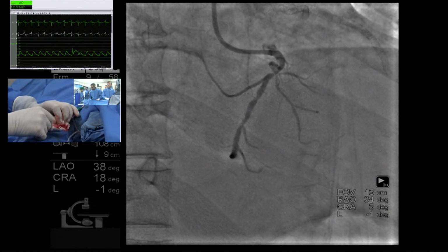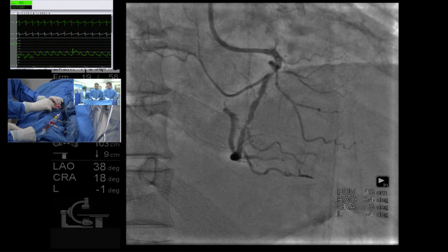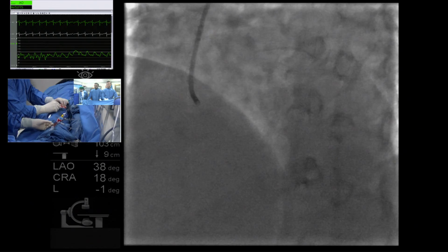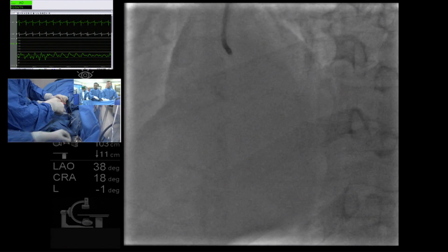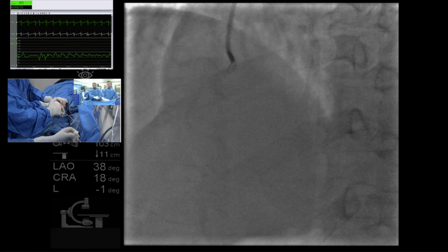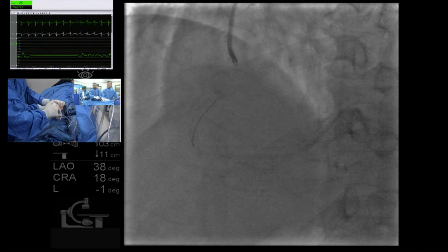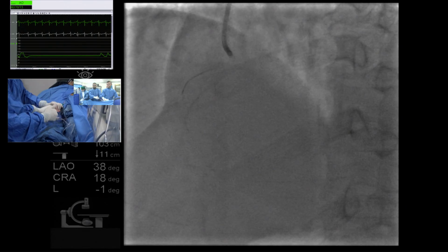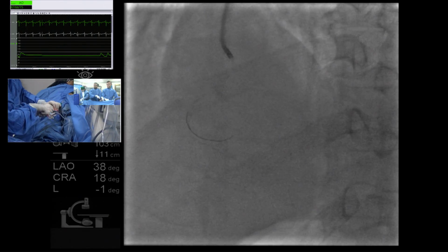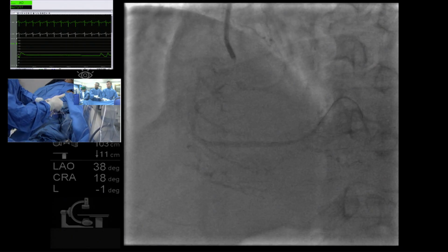So let me ask you, Tejas and Dr. Akasaka, how often are you completely wrong? Because it may be that you've learned so much from doing the imaging that you need to do less now. To start with, at least for me, I was wrong for almost 60-70%, but gradually the track record is improving, and now it's maybe around 20-25% of the time. I think that's a big lesson that even after all this experience, you could be wrong 1 out of 4 times. So it's always better to do it rather than not.